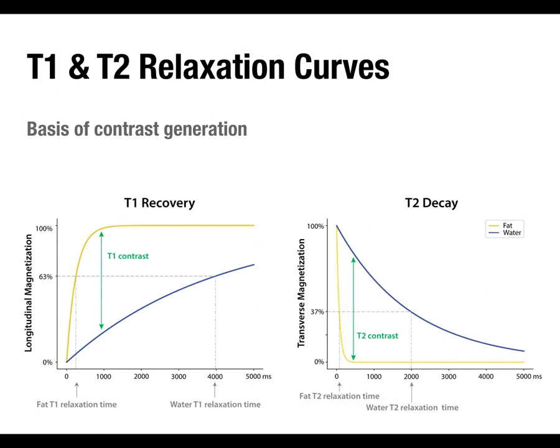And by contrast, I mean the fact that if you've got a slice of the brain and the head, you can tell where the skull is and where the brain is and where the gray matter is versus the white matter versus the CSF. That's contrast, because some parts are dark and some parts are bright, some parts are gray. And really, if you think about it, the gray matter is mostly cell bodies in the brain. White matter is mostly fat because it's axons that are coated in myelin sheath, that's fat. So you get a really strong contrast in the brain between the gray matter and white matter. CSF is essentially water with other stuff in it, so it's very watery even compared to gray matter. So you get this big contrast.